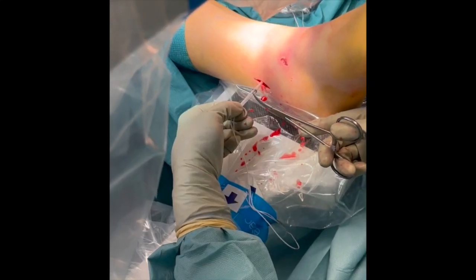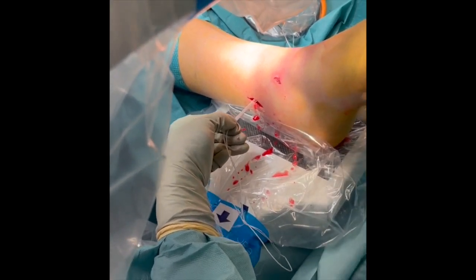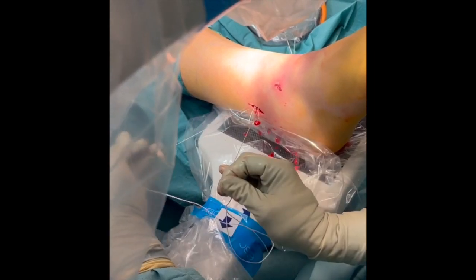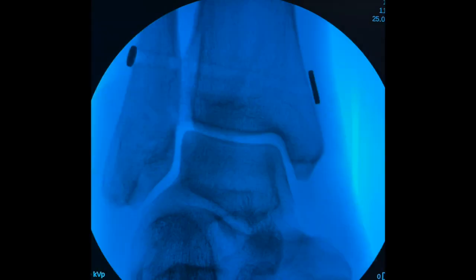By advancing the round button towards the fibula bone, one can ensure to avoid loop formation inside the bone, as one can control the loops on the lateral side while threads are toggled. Placement is controlled using fluoroscopy, skin is closed with sutures, and the medial clear space is normalized.